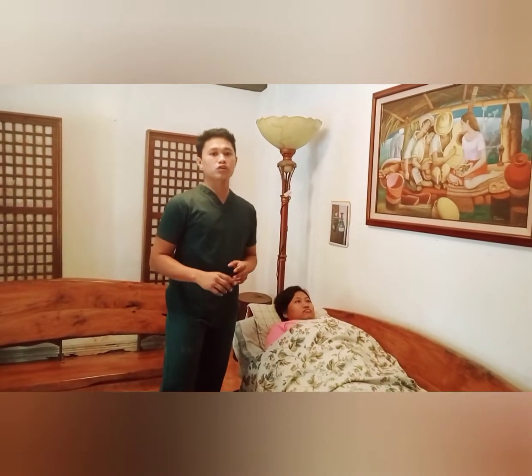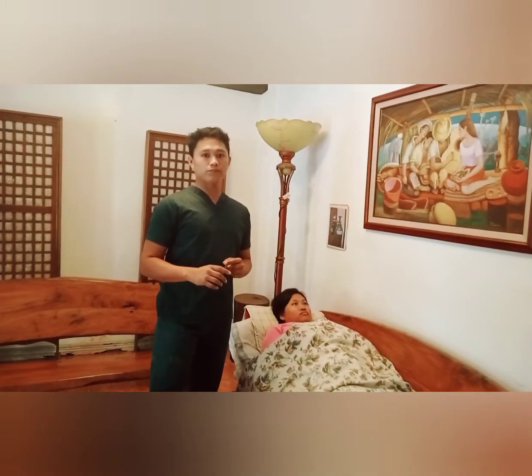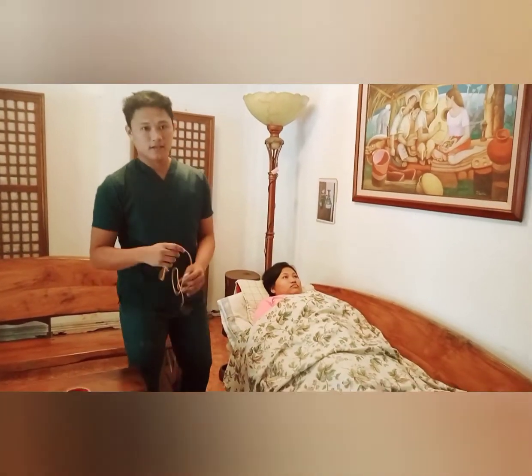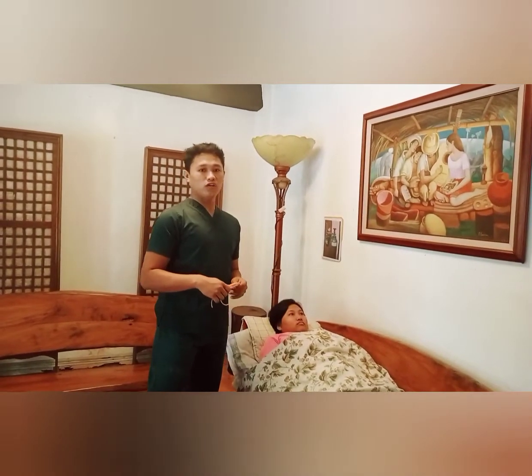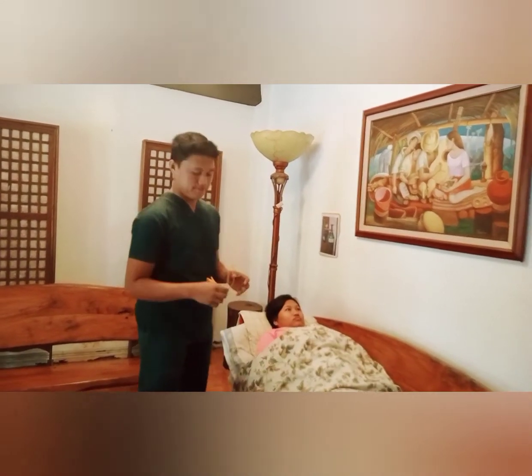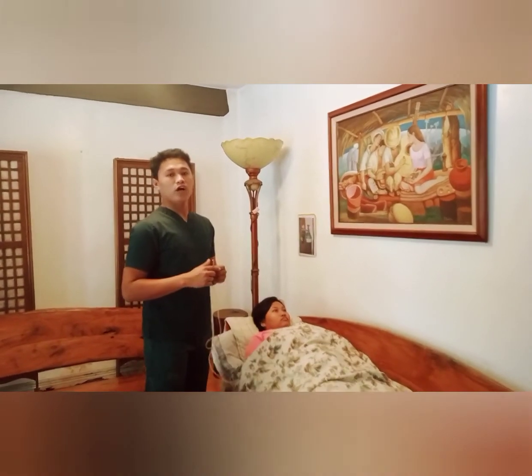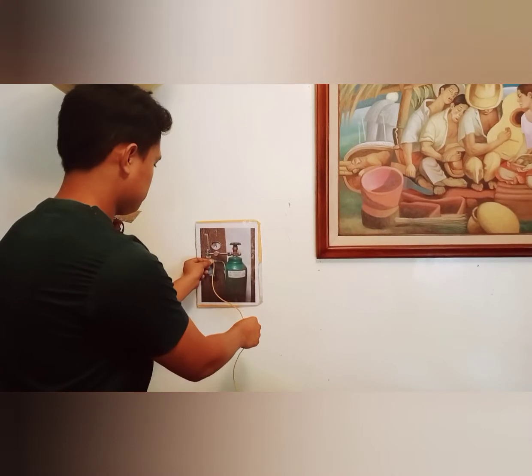Next, we are going to attach the cannula with the connecting tubing to the adapter on the humidifier. So this is our improvised cannula. We are going to attach the cannula's connecting tubing to the adapter on the humidifier. So now, I will attach the cannula to the humidifier, like this.